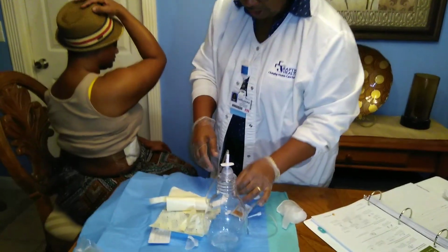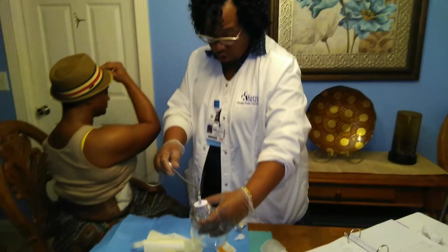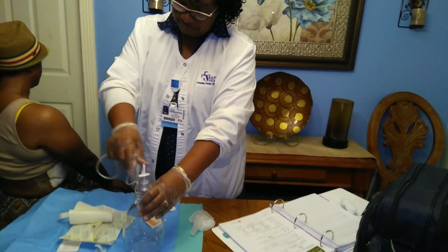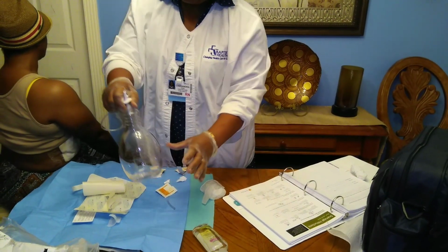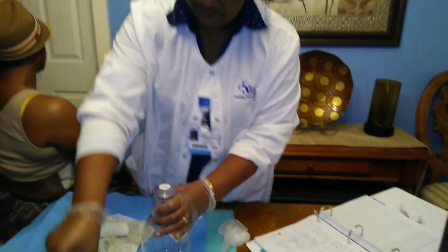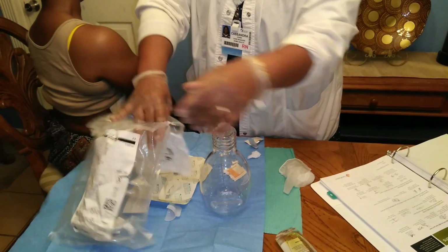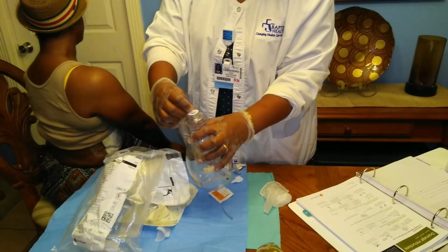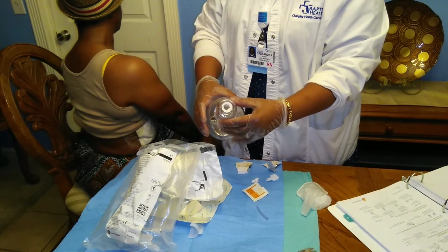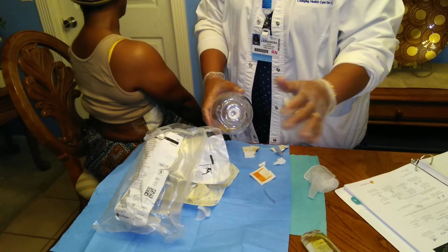Then what you're going to do is take your container. You want to always document what it looks like, how much it was. You're going to take this container into the bathroom. This comes off. I usually take my bag with me into the bathroom. I put this inside the trash. I make sure I take this completely off, because if you pour it in the toilet without taking this off, it's going to plop, plop, plop back on to you. So you want to take this whole white part off and pour it in the toilet, dispose of the drainage.